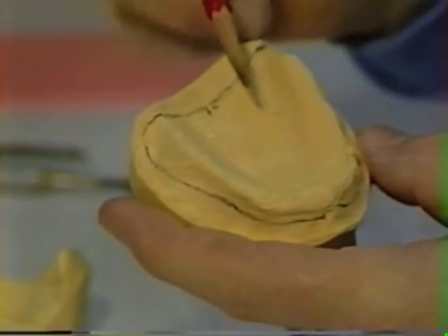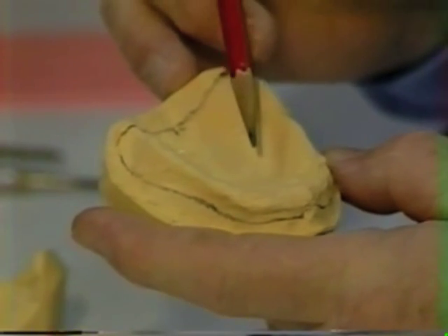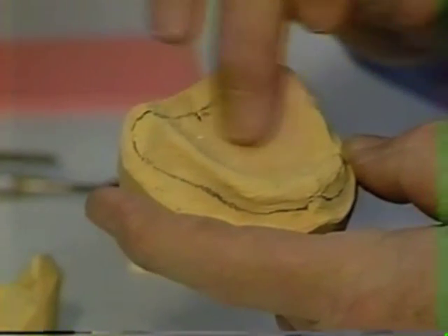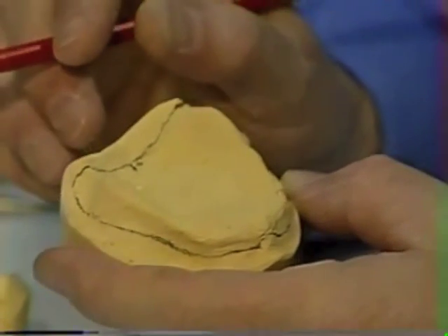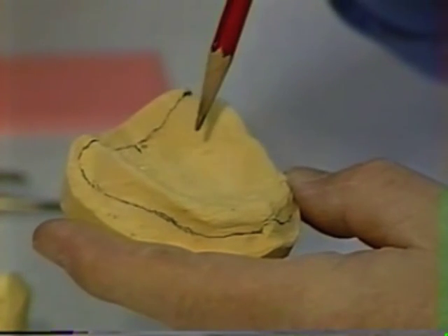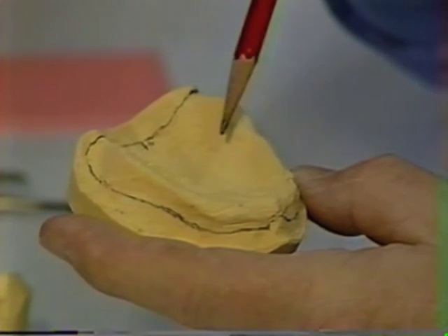In addition to that, we would like a stop on our tray. We want to use hard horizontal plates of cortical bone as a stop for our tray as much as we can. So we're going to utilize the palate for that. On the maxillary, usually the palate will make a good stop for your tray. Now if you have a torus on the palate, you're going to have to skirt that and put some relief over the torus.